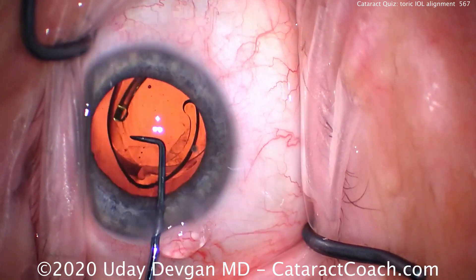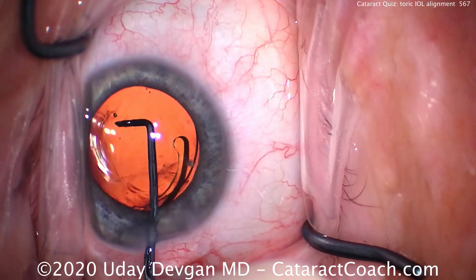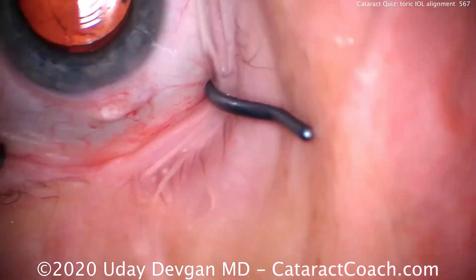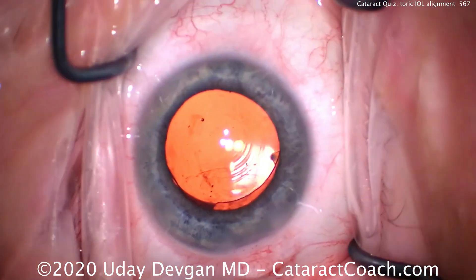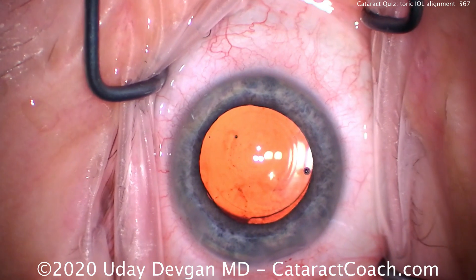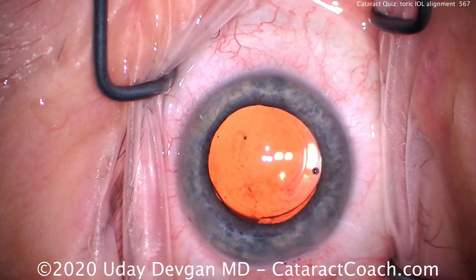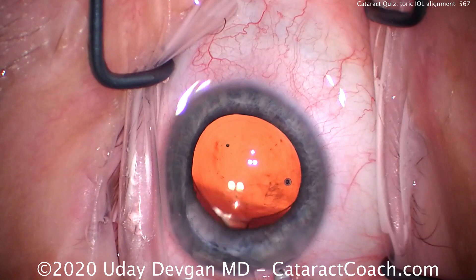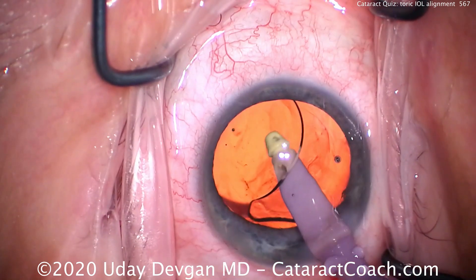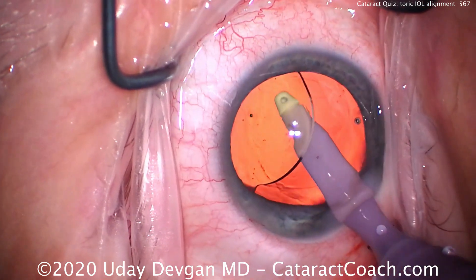Now, how do you orient the lens? I showed you at the beginning those parallel lines — they're all at the 120-degree mark. What we want to do is ensure that the center of this lens is going to be exactly in the patient's central visual axis. A good way of helping line that up is using the Purkinje images in the center of the IOL. So let's first remove our viscoelastic.